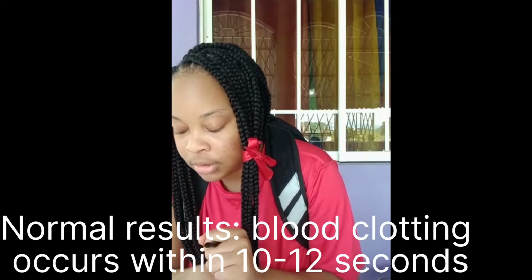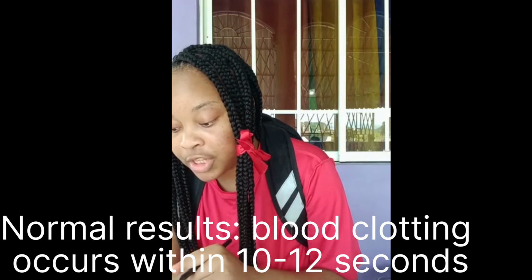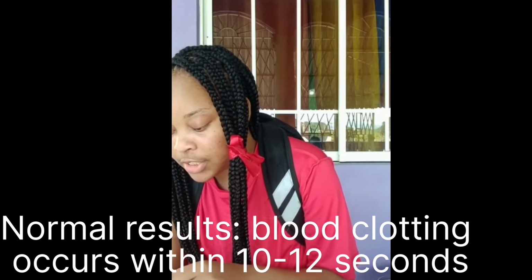These results are standardized using the international normalized ratio. Results can either be prolonged or normal. Normal results are if blood clotting occurs within a range of at least 10 to 12 seconds. If clotting occurs after this, the patient is suspected of having a clotting or bleeding disorder. There are a lot of significance to health and illness, but I'll just give you two of them.